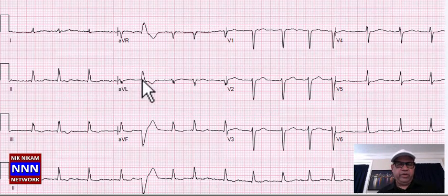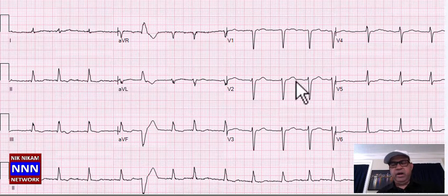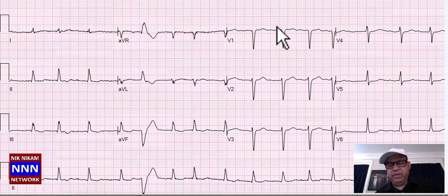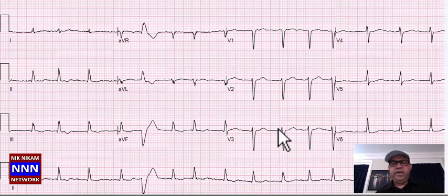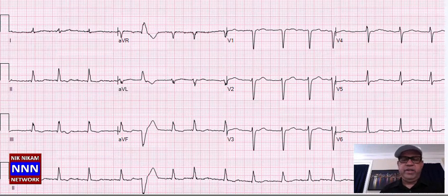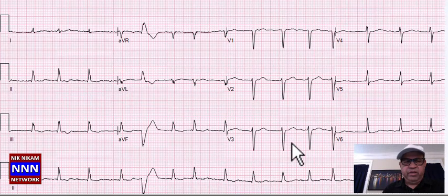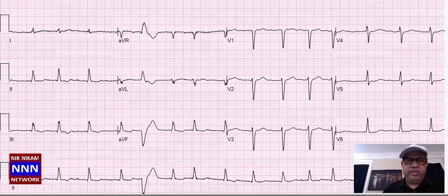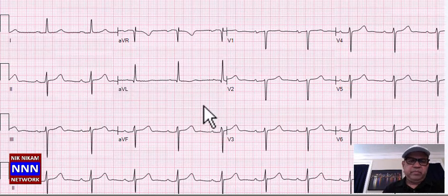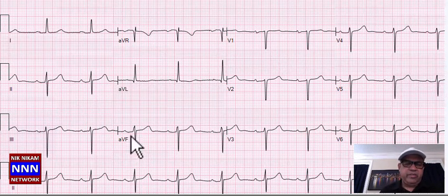QRS complex, low voltage, RR intervals varying — atrial fibrillation with low QRS complex voltage. A premature ventricular complex, loss of R-waves in the anterior leads, non-specific ST-T changes. We are dealing with atrial fibrillation, possible old anterior infarction along with non-specific ST-T changes — an abnormal electrocardiogram.